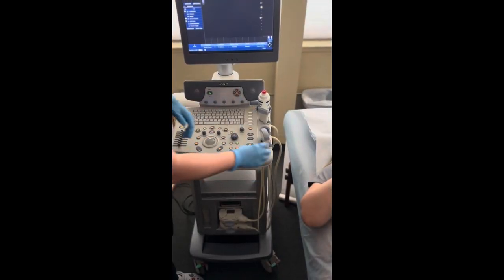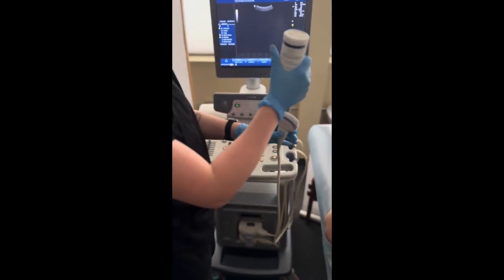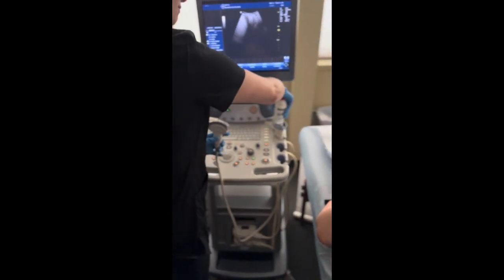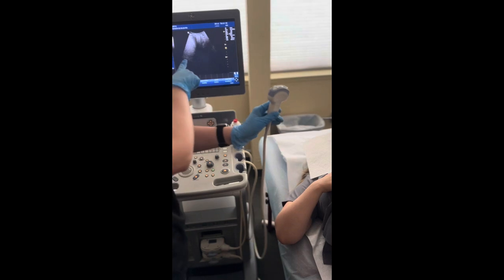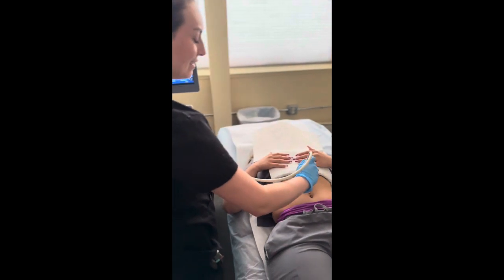After putting on our gloves, we're going to grab our curvilinear probe and our gel. We're going to apply our gel to our probe. Of course, our notch is always going to face the screen. We're going to warn our patient about potentially cold gel, and then we go ahead and apply it.